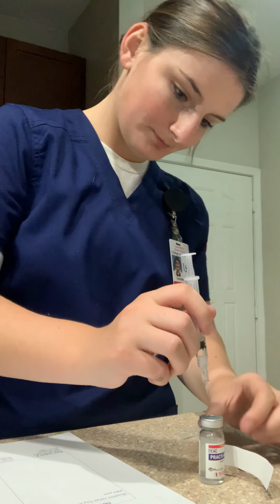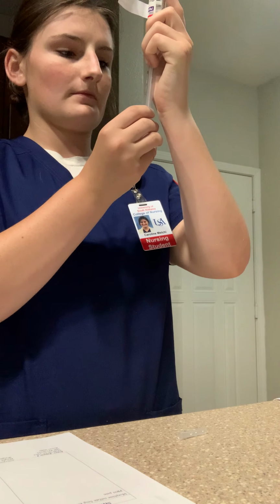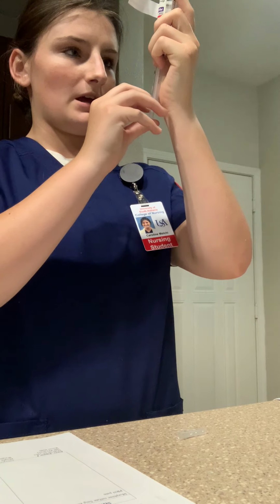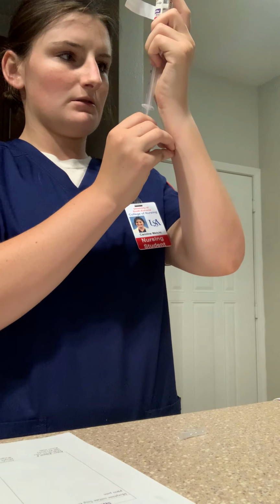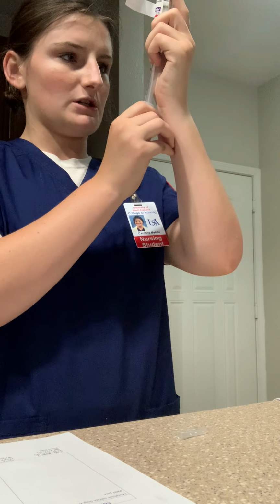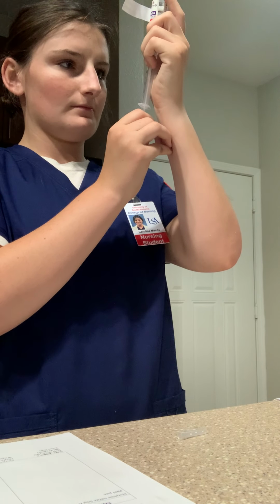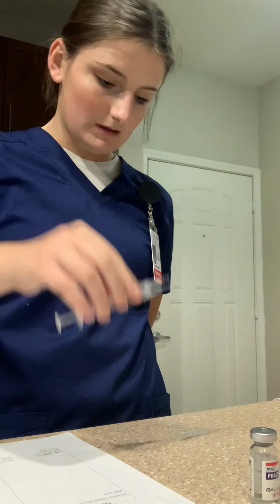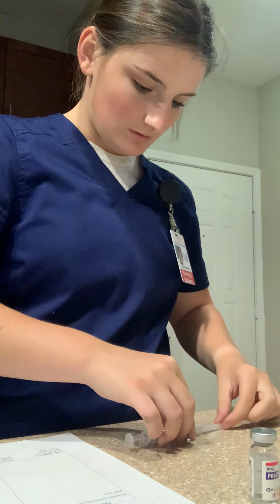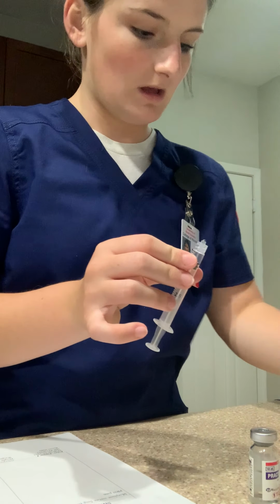Remove my cap. I'm going to be careful, push in my air and withdraw my medication, making sure there are no air bubbles. Okay, so I'm going to flip this over. I'm going to use the scoop method to recap my blunt cannula. I'm going to remove the cannula and apply my needle.